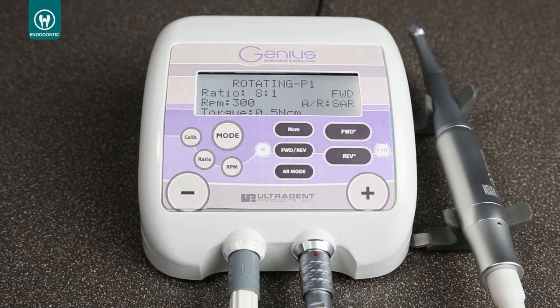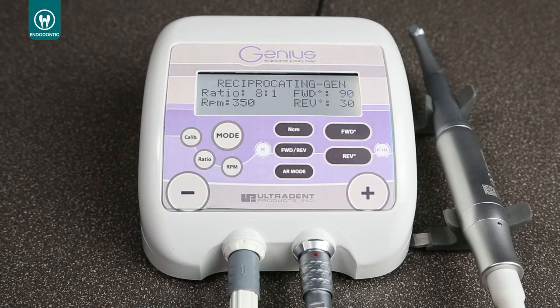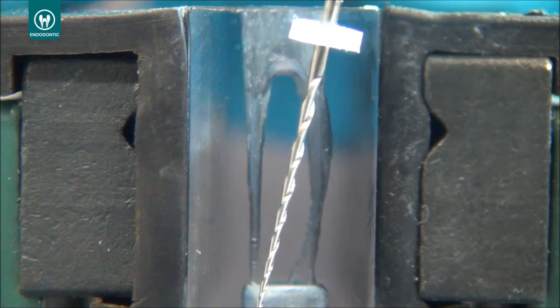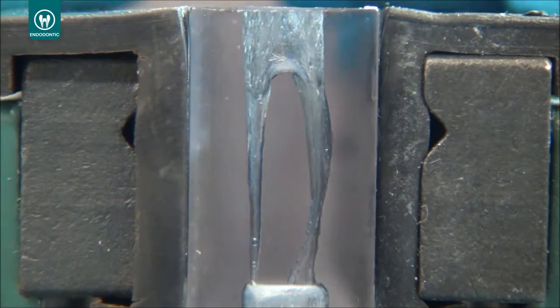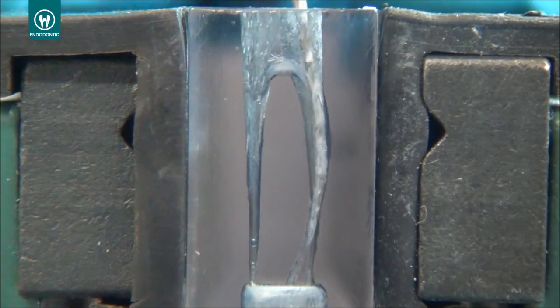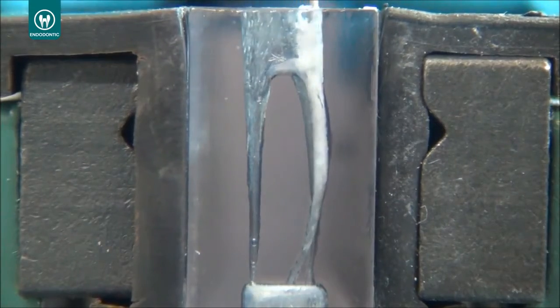So again, in reciprocation, you go until the working length safely, and then using the 90-30 movement, and then you just switch from reciprocation to rotation to remove debris. So this is the 35/04 file that will go in reciprocation. You can see that after the 25/04, the 35/04 will be a little bit more free to go until the very end or the very apical third. That will be easier than using the 25/04.